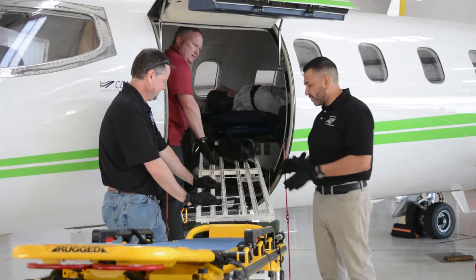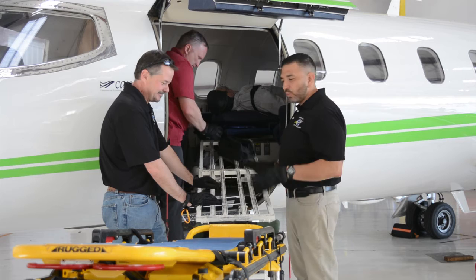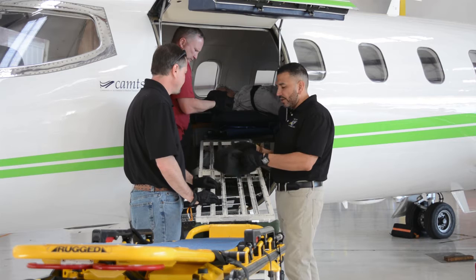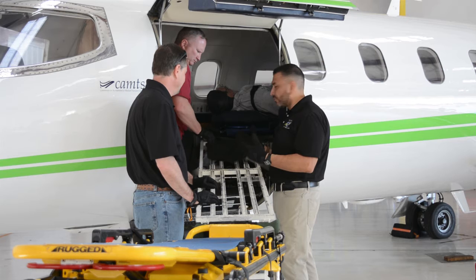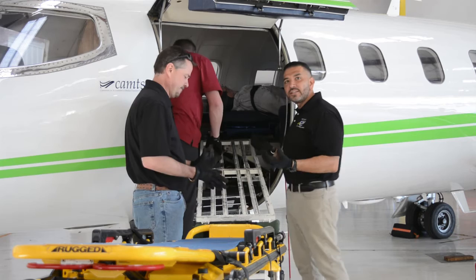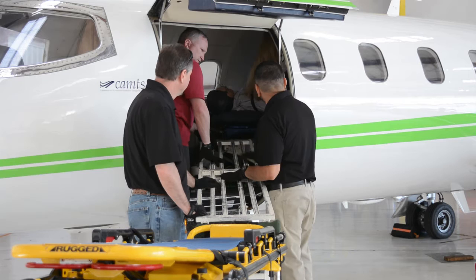Okay, so continuing on with offloading a patient utilizing the ramp, I just wanted to point out there's always gloves. We have mechanic work gloves that are located in one of the black bags that's under the airway chair. So you have one bag that has the cargo netting and seatbelt extenders, and there should be a second bag that has four pair of working gloves. Always try to use these when you're utilizing the ramp because you have a tendency to pinch your fingers underneath the stretcher as you're coming out.